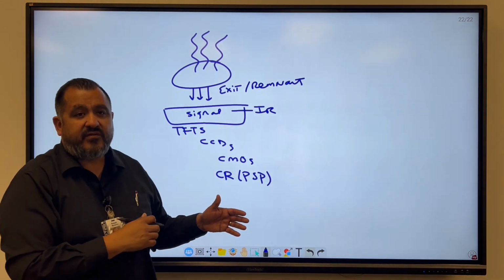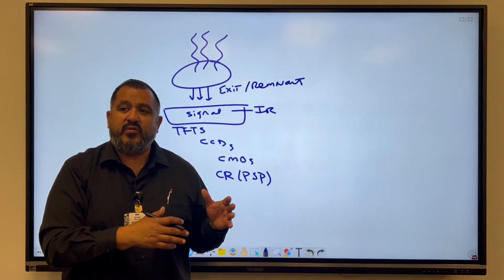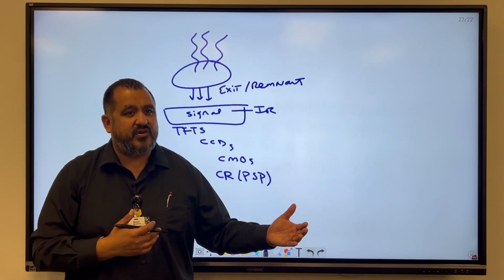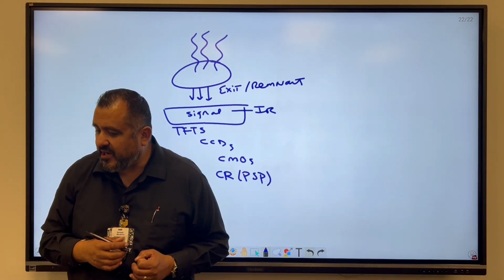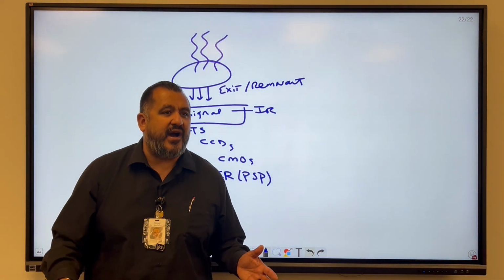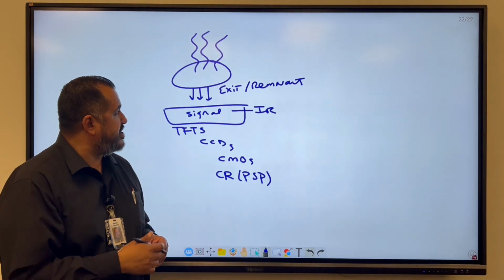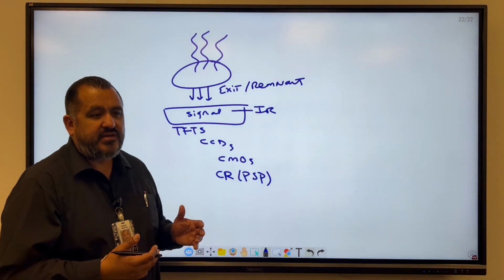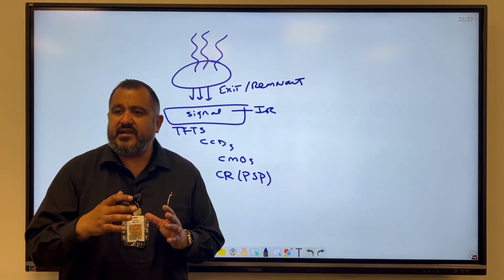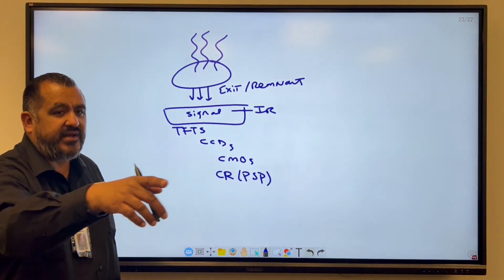So today, we're gonna focus on what's gonna increase exposure. If you know what increases exposure, you're gonna know the opposite, what's gonna decrease exposure, correct? And again, I'm referring to chapter 26. There's a chart here on page 365. I love the charts. We're looking at the Carlton Allen textbook again. If you have a different textbook, maybe a Bushong or something, there's gonna be something at the end of the chapter that tells you exactly what's happening. So page 365.